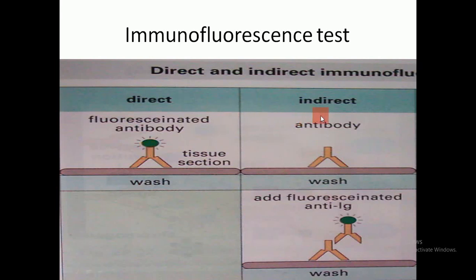While the second type of immunofluorescence is the indirect type, and we use a biopsy from an animal, usually a rat or mouse, taken from the liver, stomach, or esophagus.